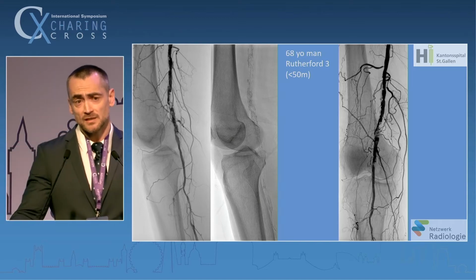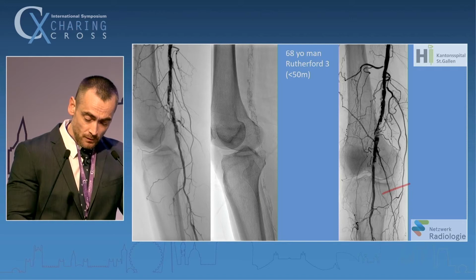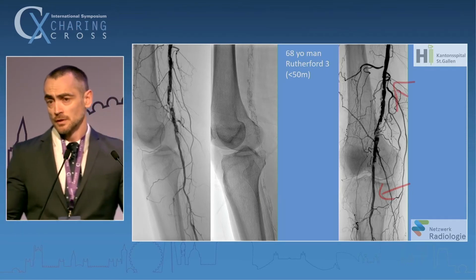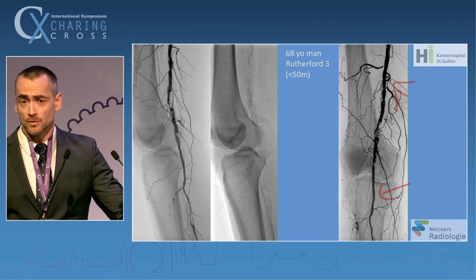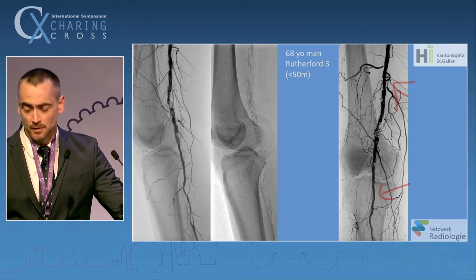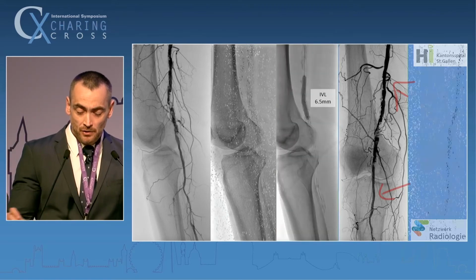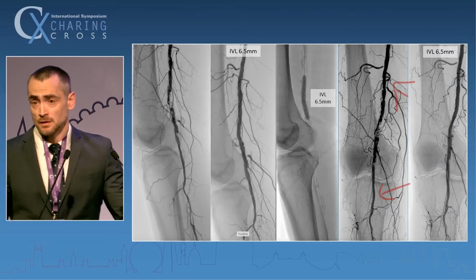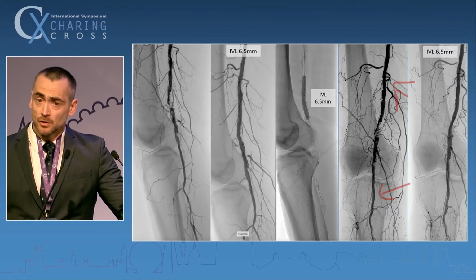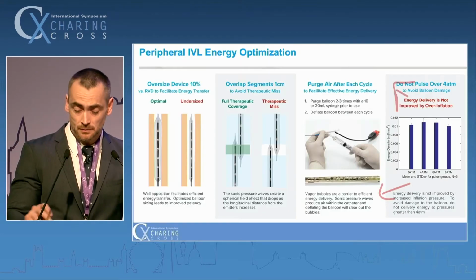The problem with a stent in this case is that you have a mismatch from the distal landing zone to the upper landing zone, where you would use a stent that's oversized and will create, with chronic outward force, intimal hyperplasia in the P3 segment. Or you have to use 2 stents. But if you use IVL, you get this result. This is not a perfect result, but it's not flow relevant anymore. You don't have recoil, and this patient got out without a stent.